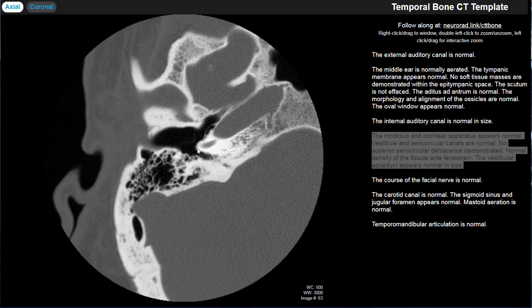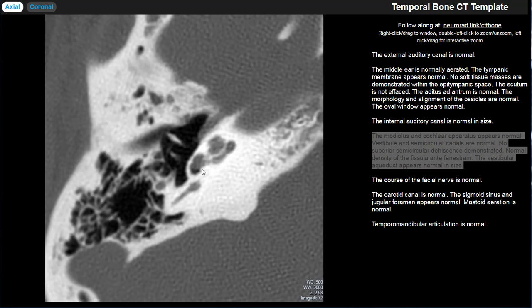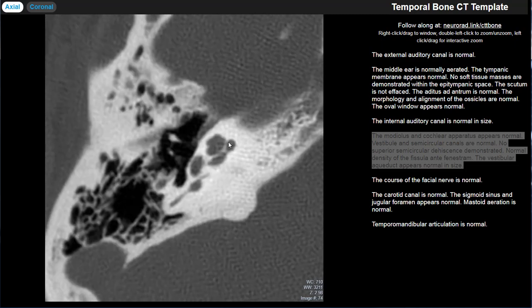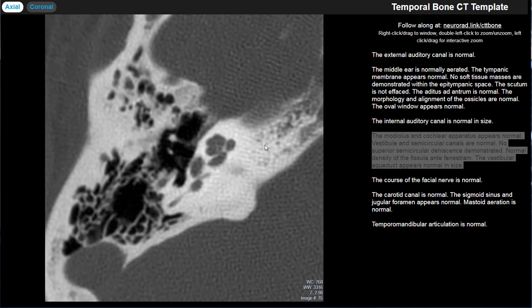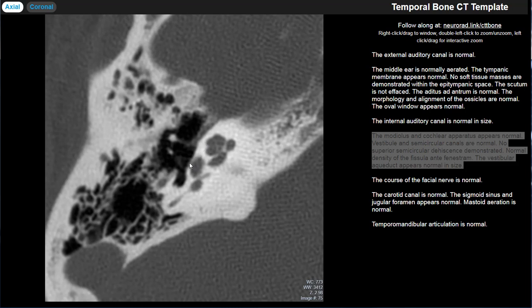The last point regarding the otic capsule is the fissula ante fenestram. 'Fissula' means cleft and 'ante fenestram' means in front of the window — referring to the oval window. So it's the cleft in front of the oval window. The bone in front of the oval window, lateral to the cochlea, is what you're identifying. When you get otospongiosis or otosclerosis, it starts with bony resorption of enchondral bone beginning in this area — so normal bone here should be nice and dense. If you're losing density there, that suggests otospongiosis.